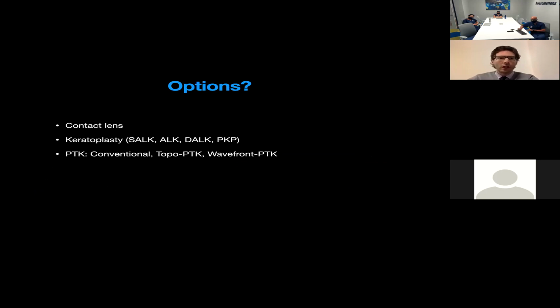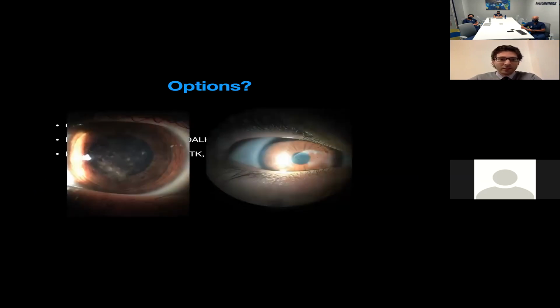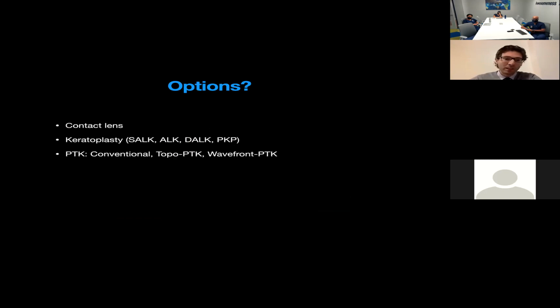What options do we contemplate for this patient? So my first option for him would have been to do a contact lens fitting, that we know do a very good job replacing the corneal surface and improving the irregular astigmatism. Like in these two patients, for example, these are two pediatric patients. The one on your left is a post-adenovirus corneal scar, and the one on your right is a post-traumatic corneal flap. And both of them are seen 20/20 with a contact lens. But this patient, because he's a senior patient that didn't want to use a contact lens, and because he's a farmer, so his work environment maybe wasn't the best for a contact lens user.